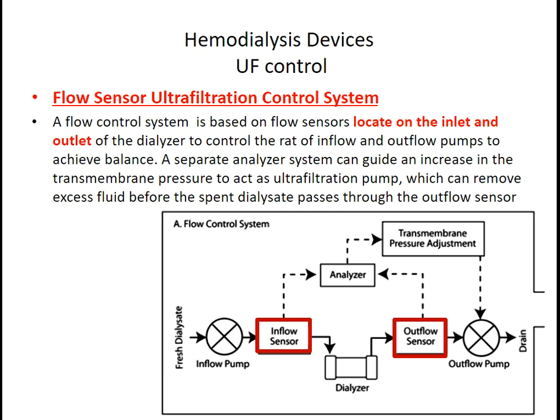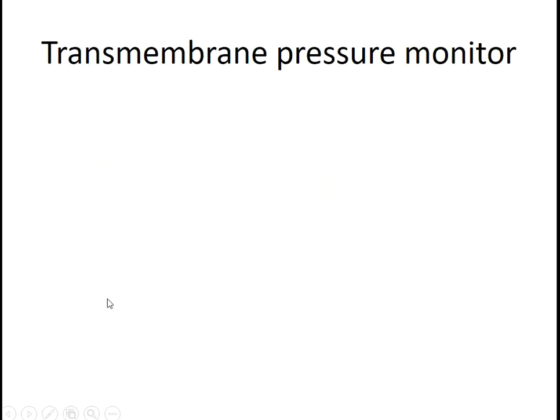A separate analyzer system can guide an increase in the transmembrane pressure to act as an ultrafiltration pump, which can remove excess fluid before the spent dialysate passes through the outflow sensor. We have inflow sensor, outflow sensor, analyzer adjusting the transmembrane pressure. Transmembrane pressure monitor.